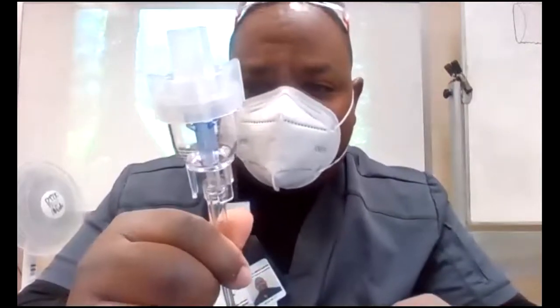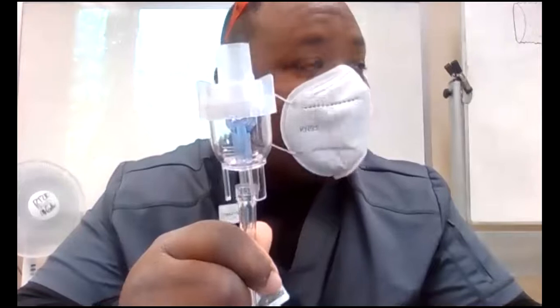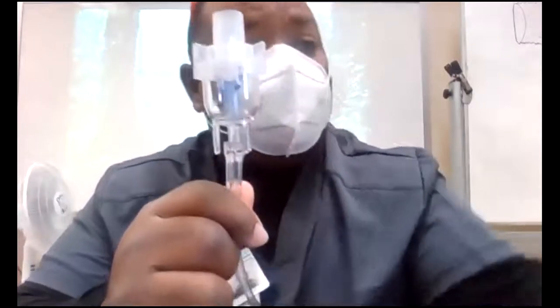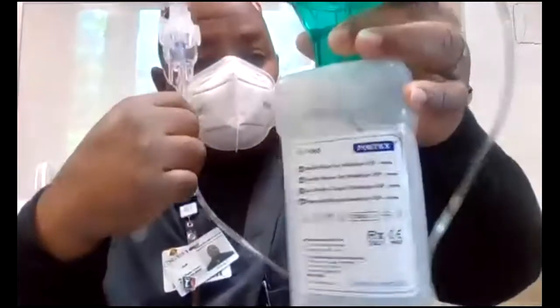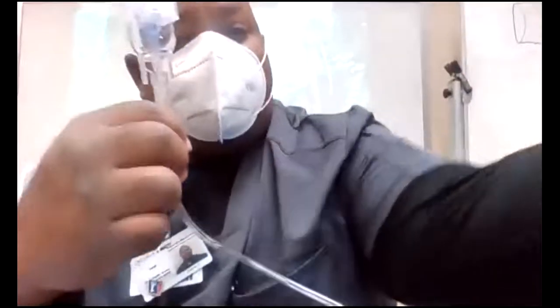20 cc's or less is considered a small volume nebulizer, okay? This one is about 6 to 10 milliliters, because it says 4, then it goes up. It's about a 6 to 10 milliliter container. So this is a small volume nebulizer, SVN. You'll see it as SVN. The large volume will be the LVN, which will be this one. This is the large volume because it has 1,000 milliliters of water in it.